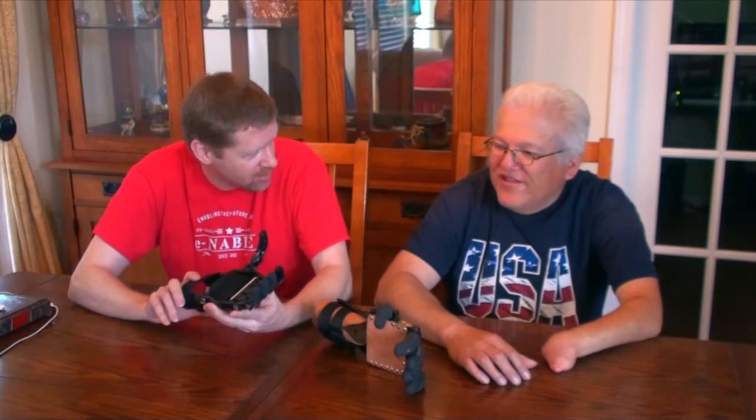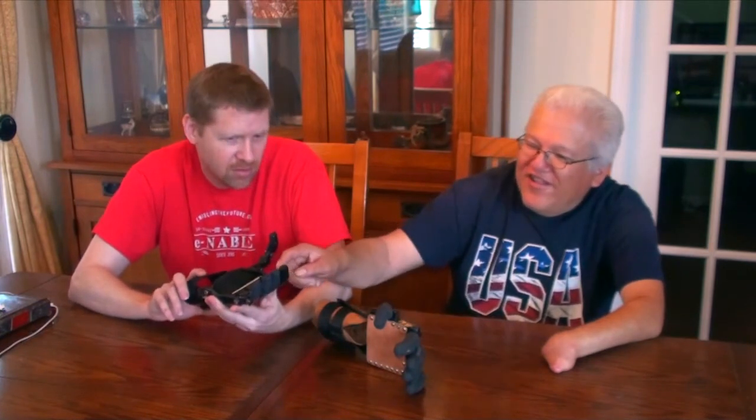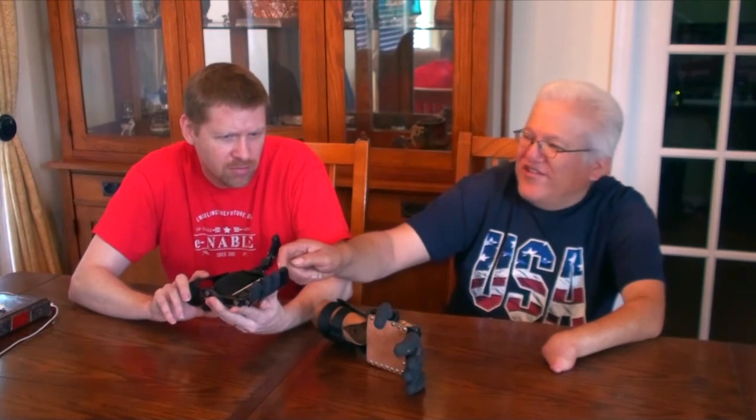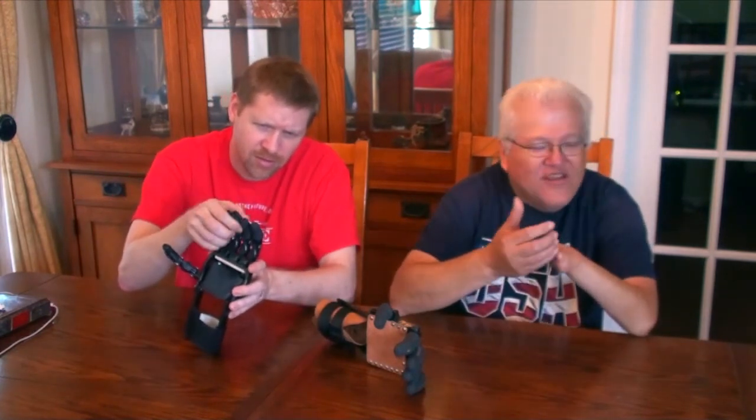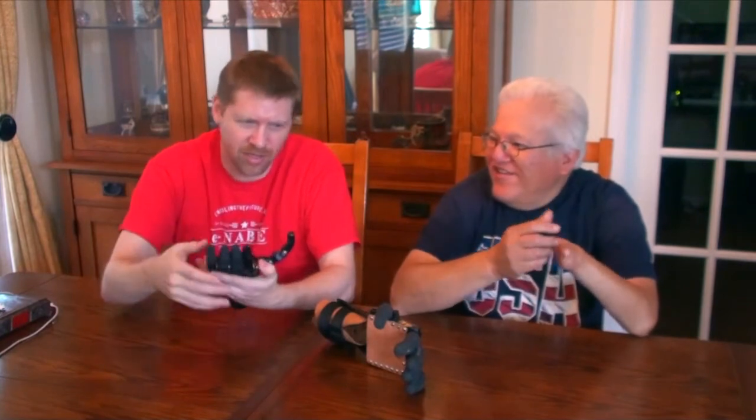When you were using the Cyborg Beast before, were you using it about six hours a day too? About the same, but these kept slipping. And they had a little rubber piece that kept falling off. Okay, so maybe something like this would work a little bit better.